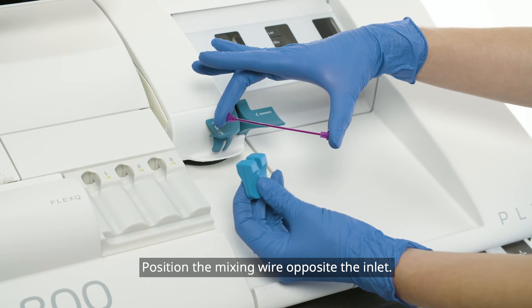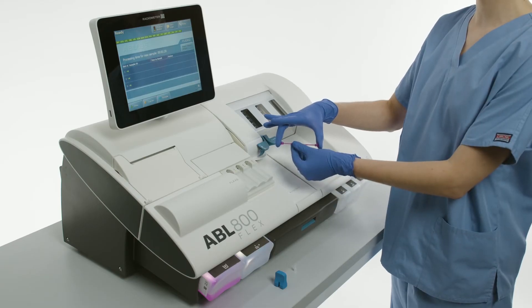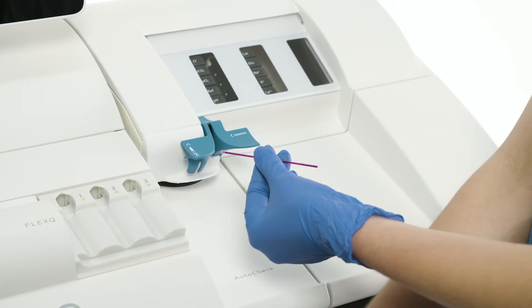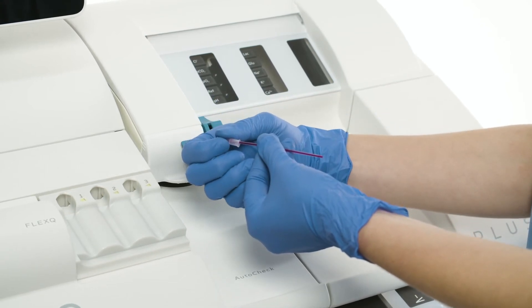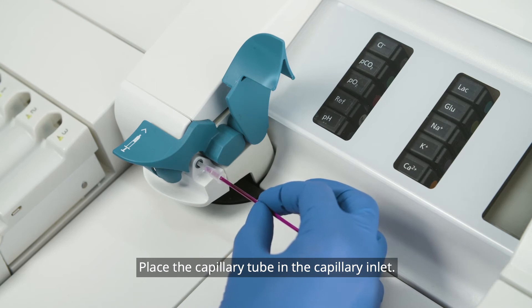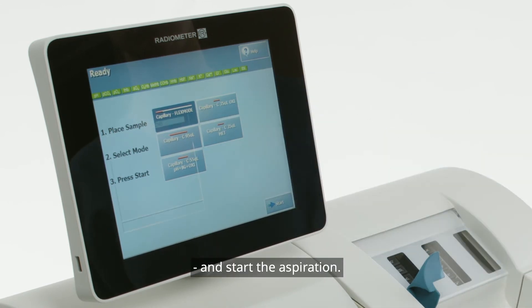Position the mixing wire opposite the inlet. Remove the end caps and place the clot catcher on the capillary tube. Lift the capillary inlet flap. Place the capillary tube in the capillary inlet. Select the desired mode and start the aspiration.